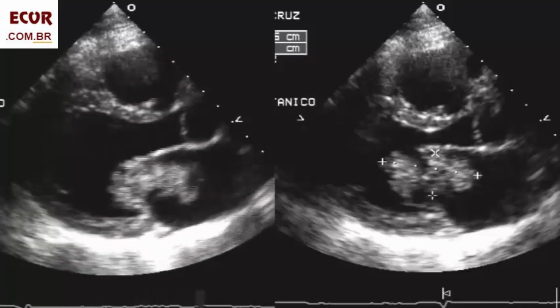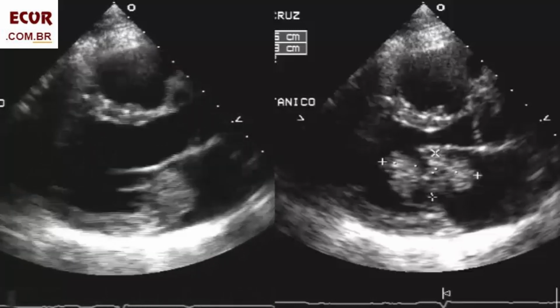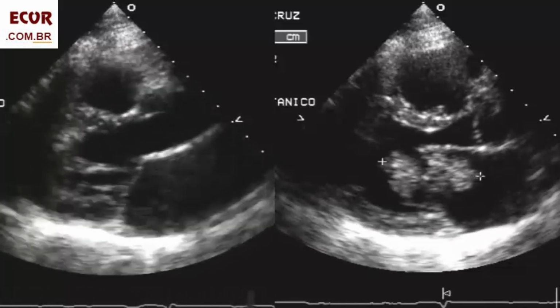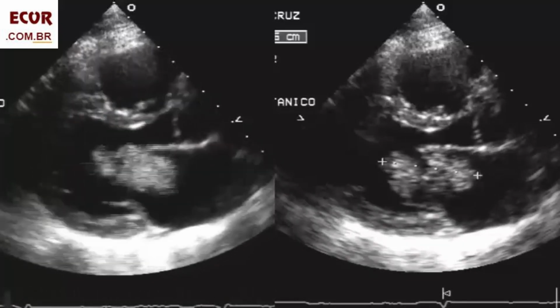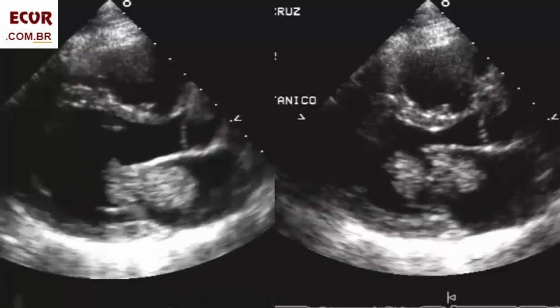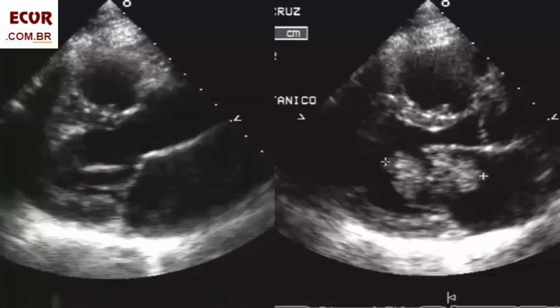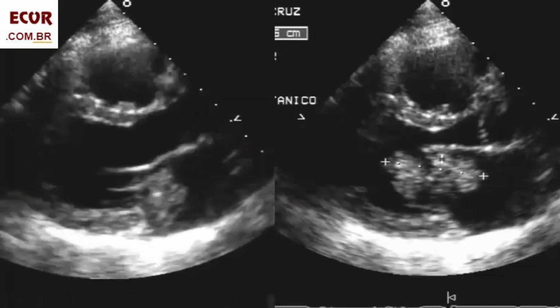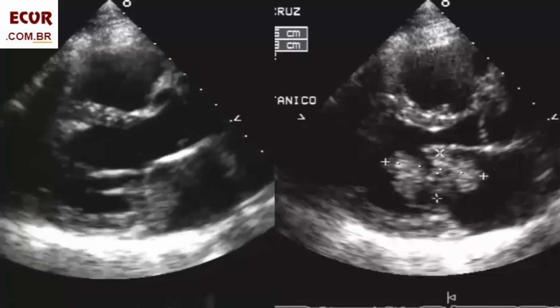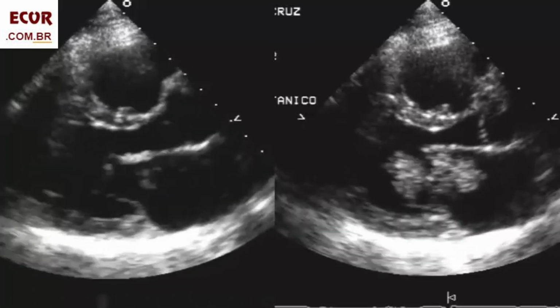The diagnosis is easily made in this view, where we're going to measure it. Notice how it may seem friable, easily compressed and deformed. It may look quite jelly-like. Next, we must ascertain its attachment to the atrial septum, since this is its main characteristic. When we demonstrate its attachment to the interatrial septum with a pedicle, we may be very confident it's a myxoma.